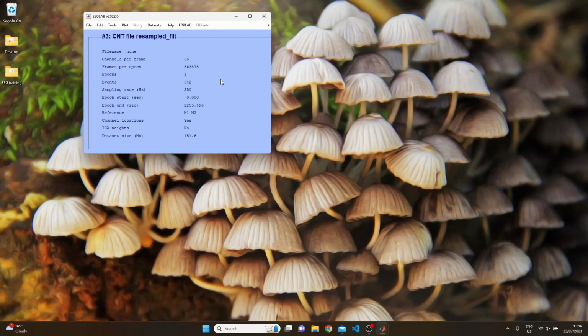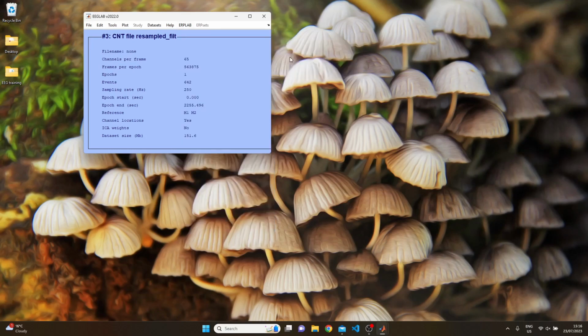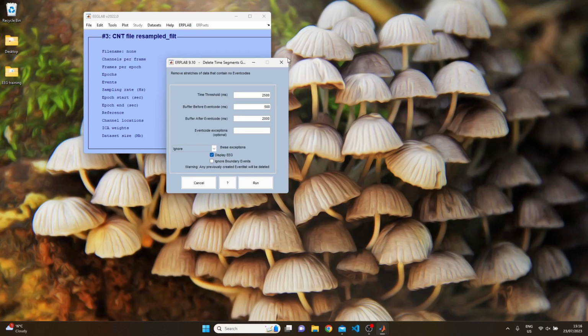This can be done both automatically or manually, but I'll talk you through the automatic rejection here because it'll save you a lot of time. So to do this, you go to EEGLAB, Pre-Process EEG, and Delete Time Segments. On this menu that pops up, you'll see a number of criteria that you need to input.